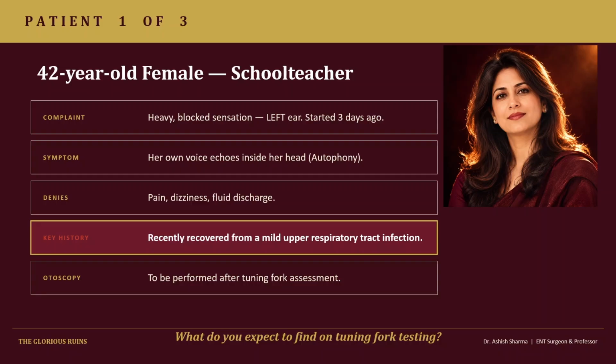But here is the detail that immediately gets my attention. She recently recovered from a mild upper respiratory tract infection. I pick up my 512 tuning fork, Weber first, midline forehead. She immediately says, I hear that buzzing much louder in my left ear. My internal monologue? Well, sound lateralizing to the symptomatic left ear.